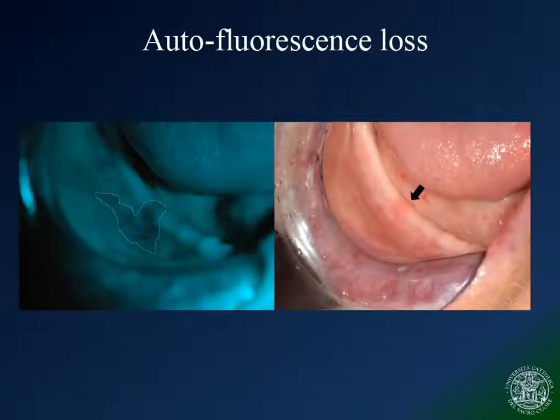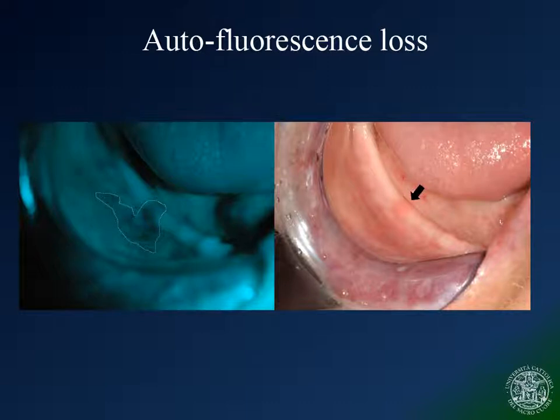Here you can see an oral cancer in an edentulous patient in follow-up after surgical resection of a malignant lesion. The lesion is barely visible if the oral examination is performed with superficiality. Loss of fluorescence increases contrast, making it easier to see the tumor. Also visible is a clear difference in the extension of the margins of the lesion.